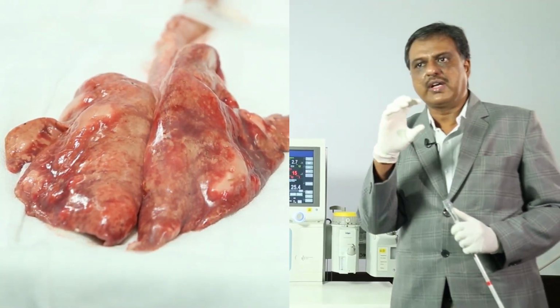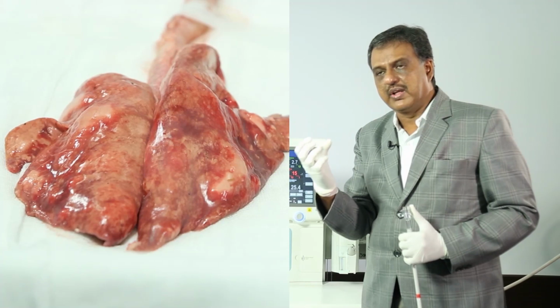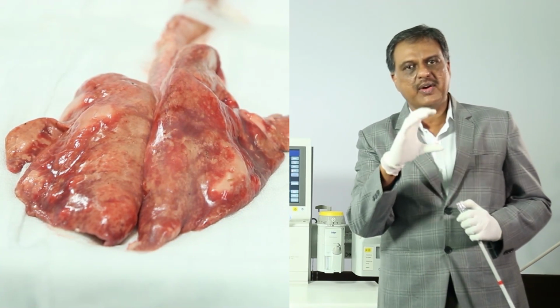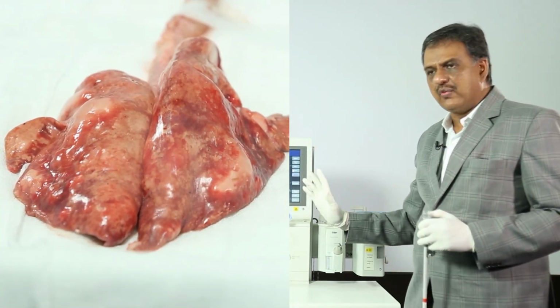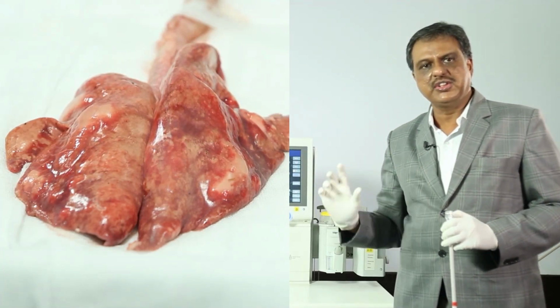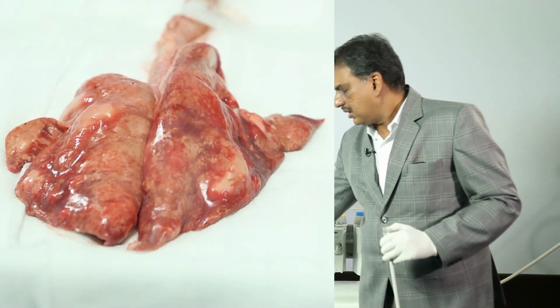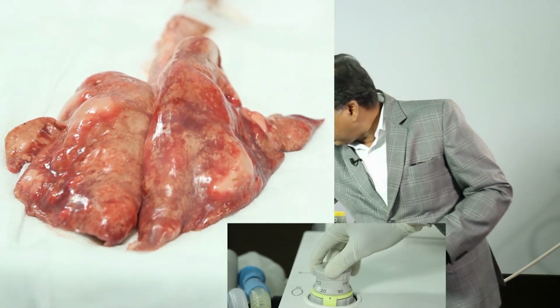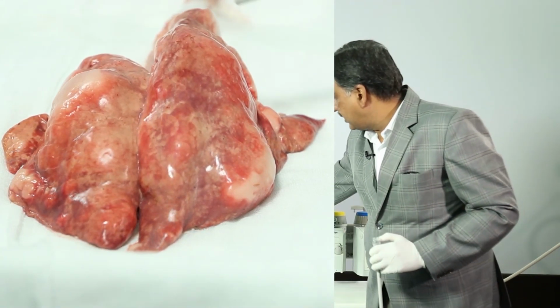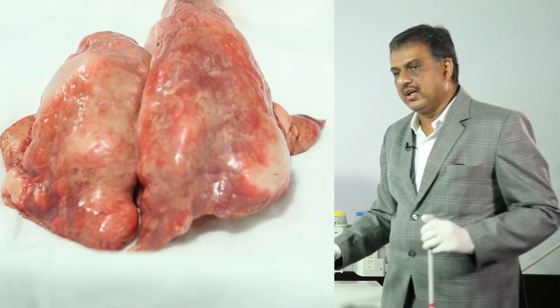To deliver a vital capacity maneuver manually, change the ventilatory setting: keep the ventilator on manual spontaneous, keep the APL valve closed at 40 centimeter of H2O, increase the flow to 15 liters, and look at the pressure and look at the lung.